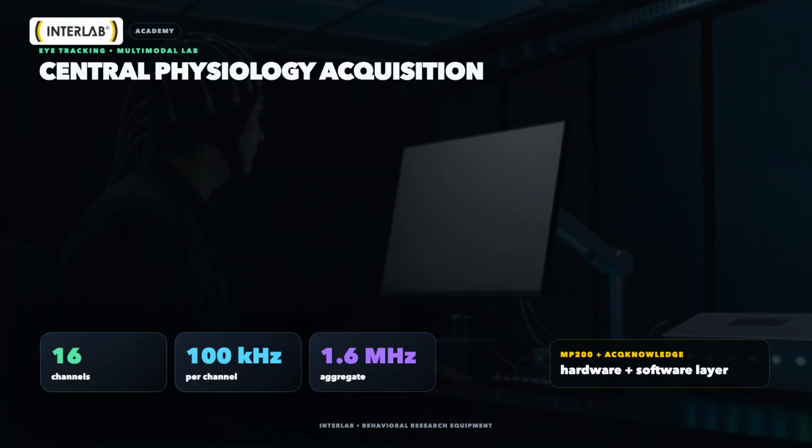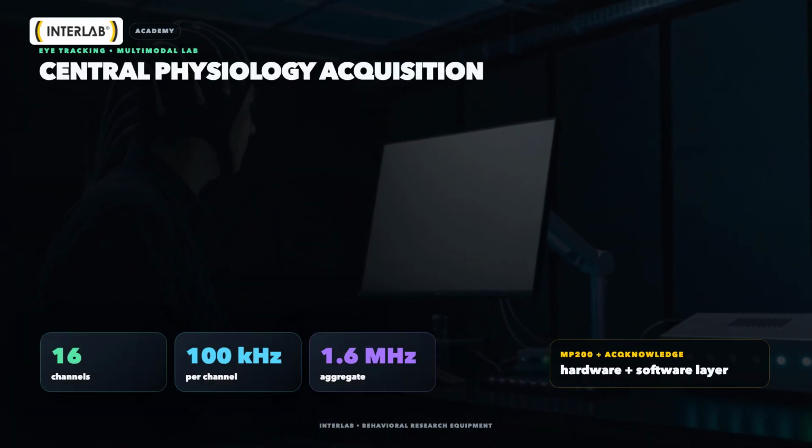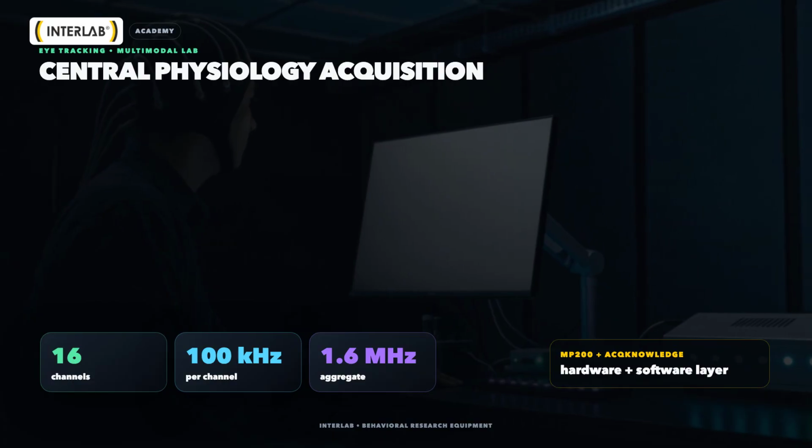BIOPAC MP200 is a central physiological data acquisition system. Depending on its configuration, it can record ECG, EMG, EEG, EDA, respiration, and other signals through the appropriate modules. The system supports up to 16 channels, sampling rates up to 100 kHz per channel, and an aggregate sampling throughput of up to 1.6 MHz. These figures do not mean that every study should run at the maximum rate. Parameters must match the signal and the research question.